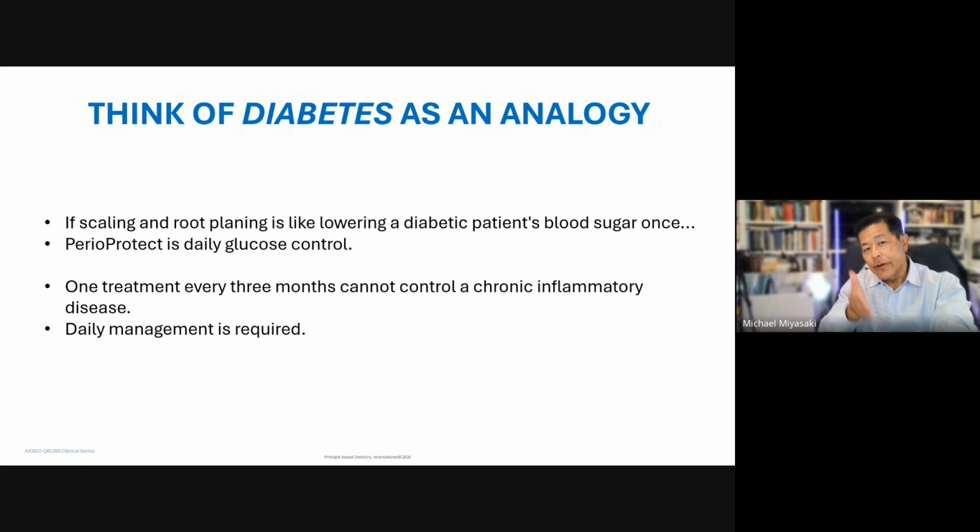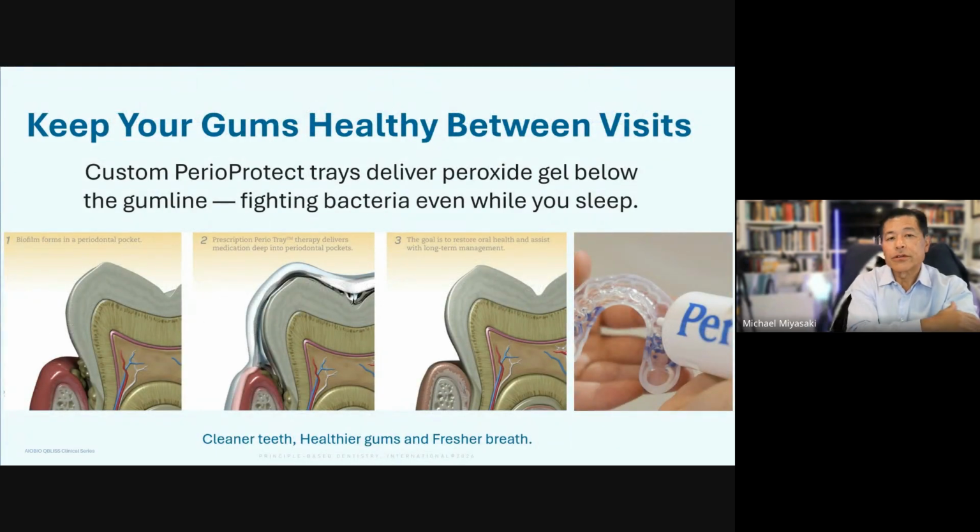A patient that has peri-implantitis, we may go in there and instrument around the implants to remove that pathogenic mature biofilm, but we need some kind of daily management. And that's what these trays are. They're to help to keep the gums healthy between visits.